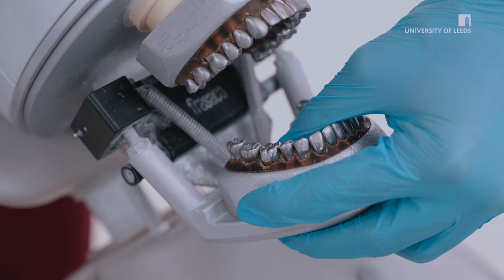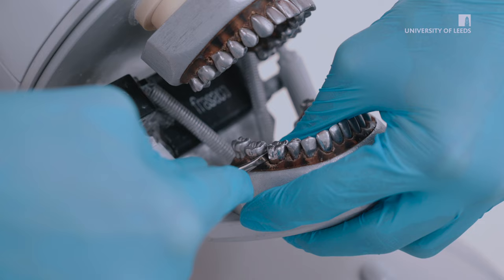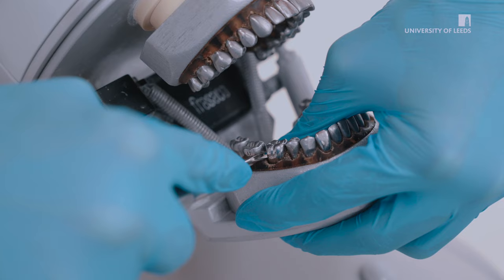Leverage is used when the elevator is applied perpendicular to the long axis of the tooth and rotated about the alveolar bone acting as the fulcrum, resulting in the tooth being displaced axially. Once sufficient mobility is achieved, the tooth can be delivered with forceps.